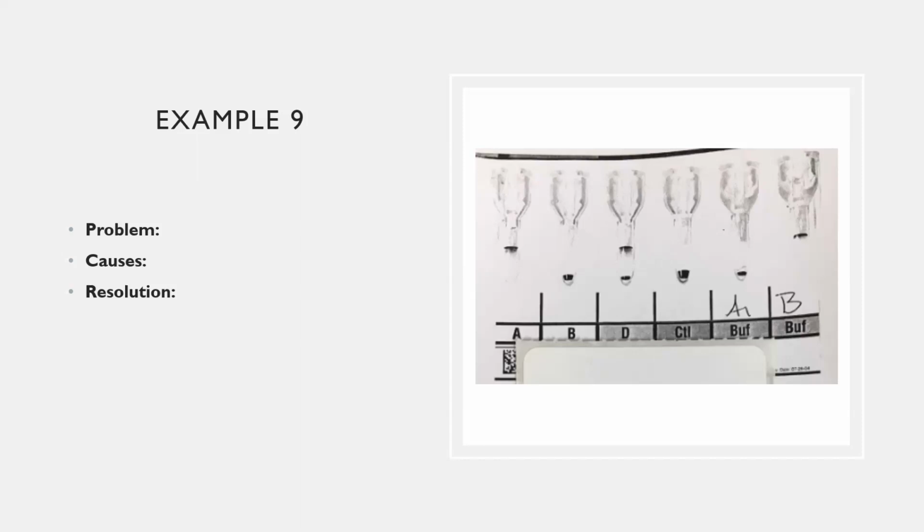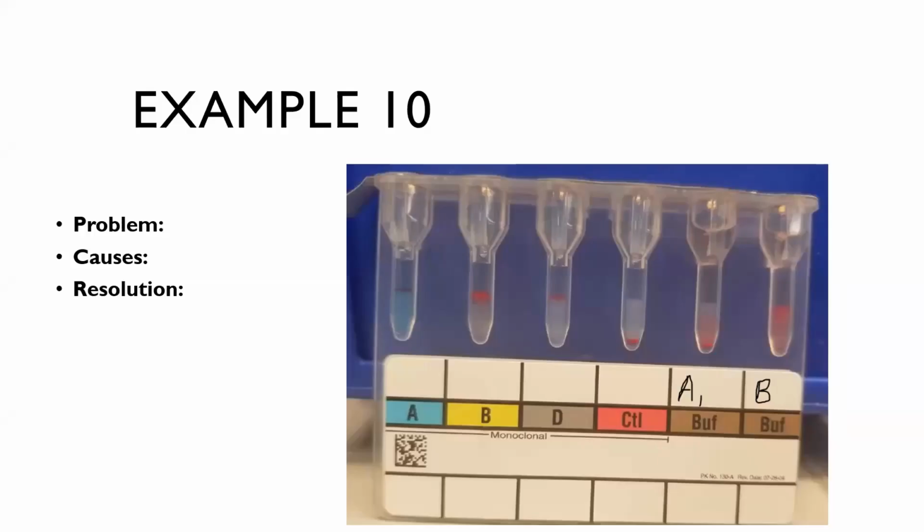So anyway, if you saw a discrepancy like this, you would look at transfusion history. It's likely due to a transfusion. And that reaction would be immediate, because you have those donor cells floating around. If they're making an antibody to the donor cells, that's not going to be immediate. It's going to take some time for those antibodies to show up on a test, for example if they had a transfusion the day before.